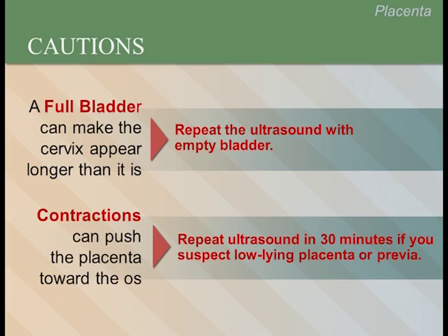Also, contractions can push the placenta towards the internal os. If you suspect a low-lying placenta or previa, repeat the ultrasound in 30 minutes when there are no contractions.